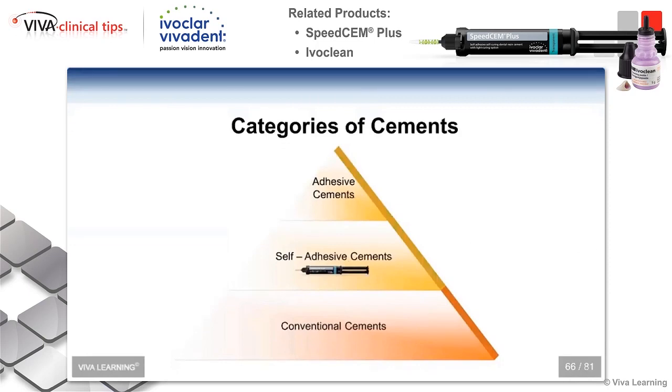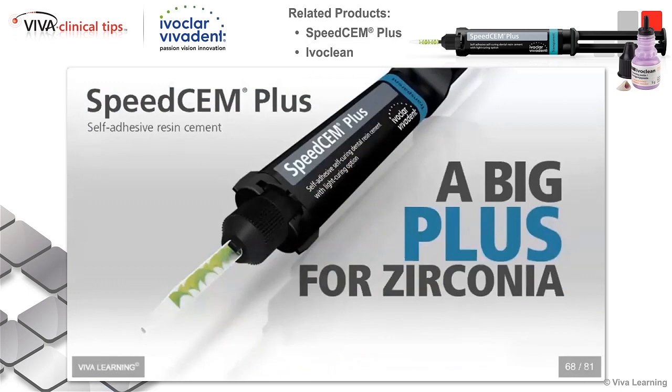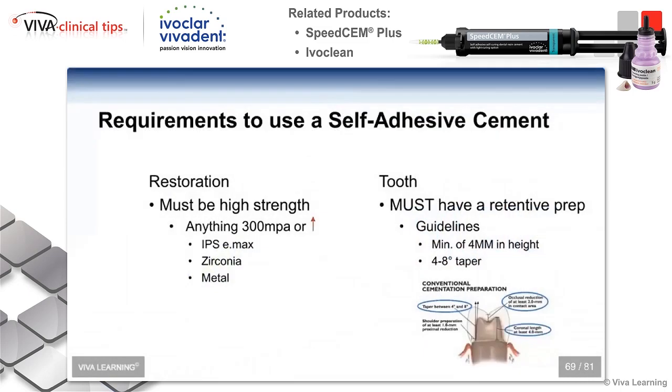Let's look at the self-adhesive cements. If you have used this category before, you might be familiar with how well it works together. And it's a really good choice for something like zirconia because of the high strength of zirconia and because of what it contains inside of here, and the reason why you can use this cement without any kind of primer.